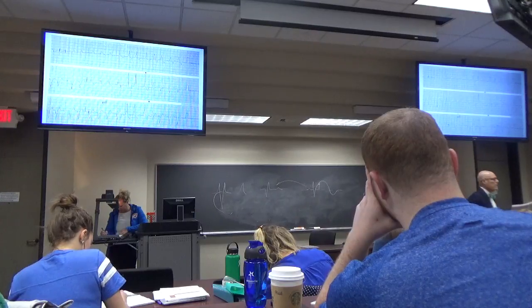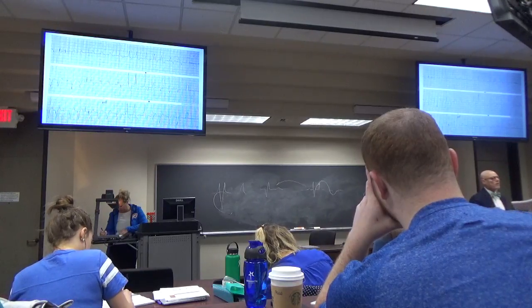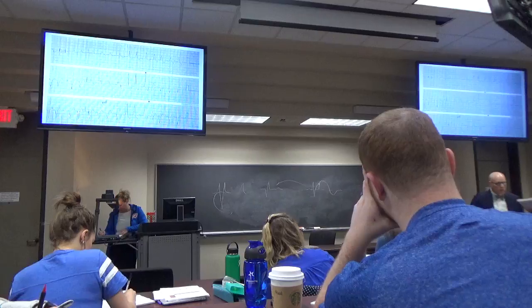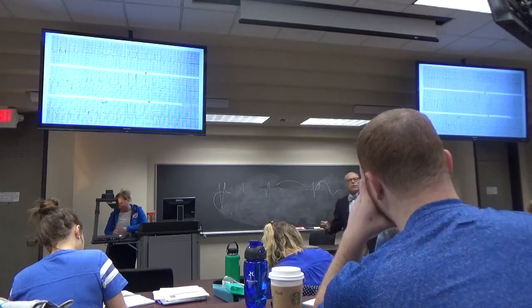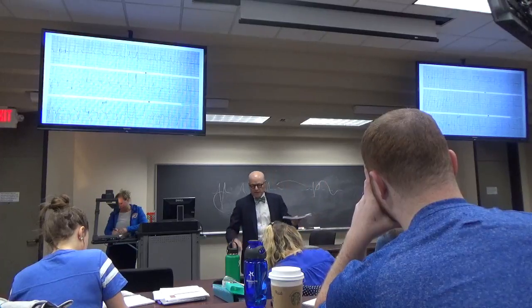What else could do this? There's one other thing. Enlarged right ventricle. An enlarged right ventricle. Right ventricle hypertrophy could do this.